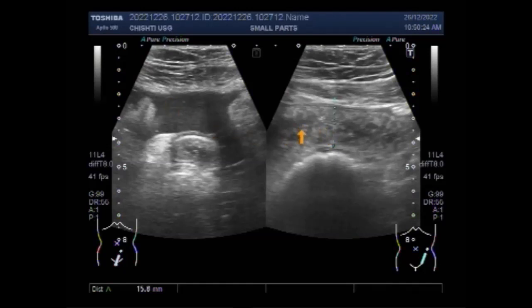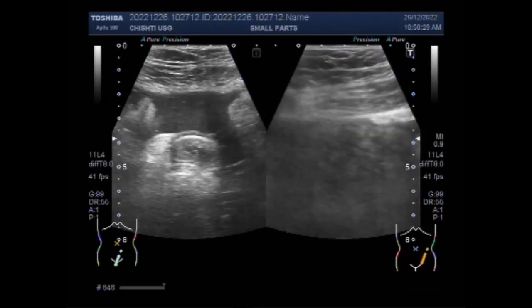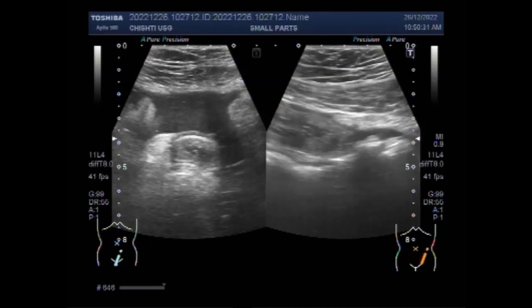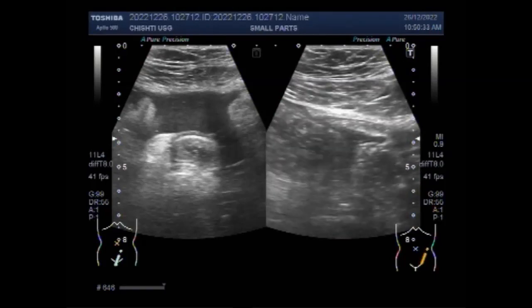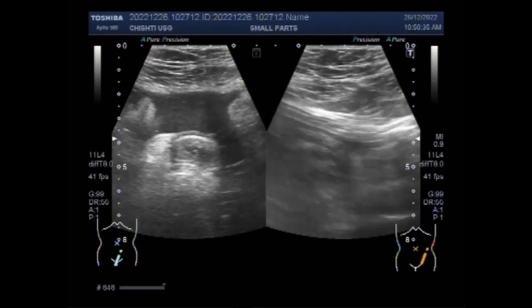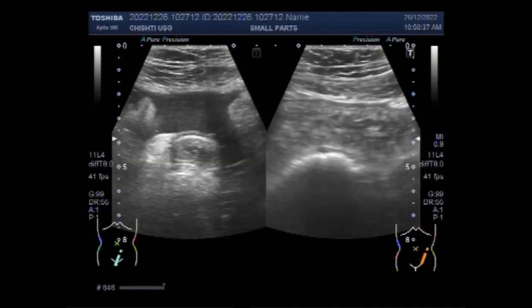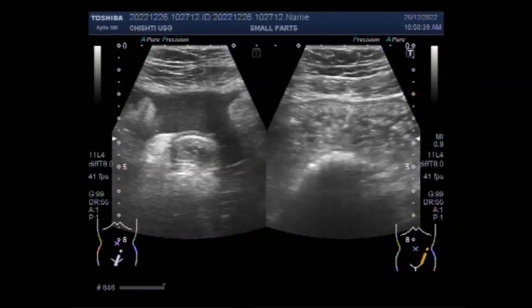This is the dilated gut loop, and its diameter measures about 2 cm. You can see the to-and-fro movements of the intestinal contents.